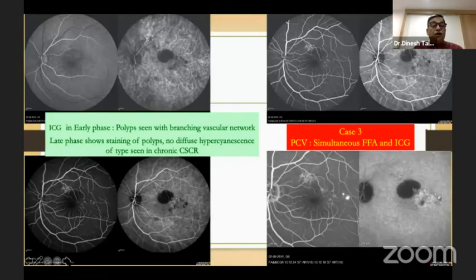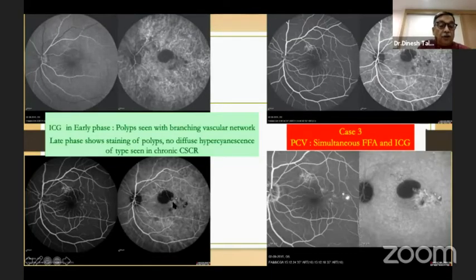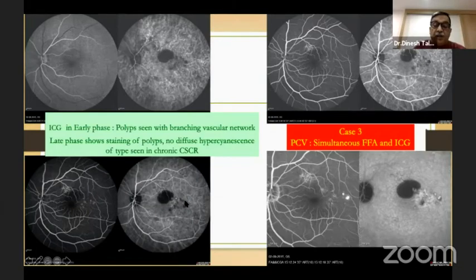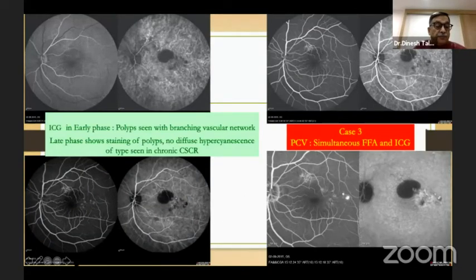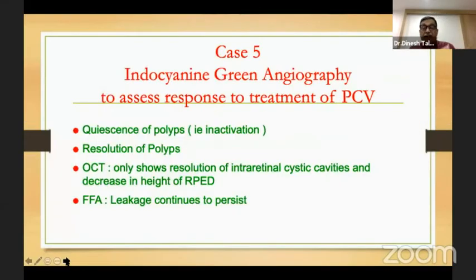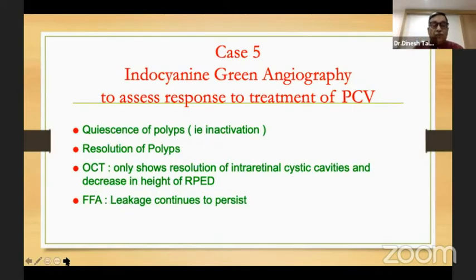Here is another patient where you can see the polyps in the early phases — the polyps are seen within the first six minutes — and then they stand out in the late phase. In this second case, no other lesion is present. ICG can also be used to assess the activity of a polyp: has it become inactivated? Has it become resolved? — which you cannot determine by any other means.